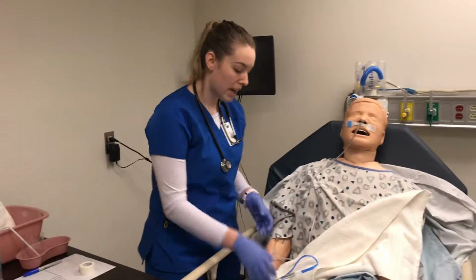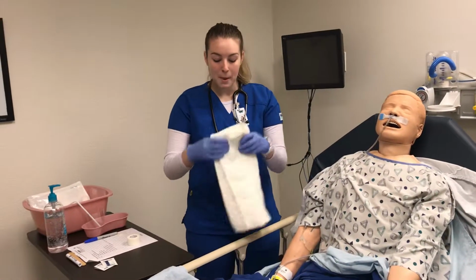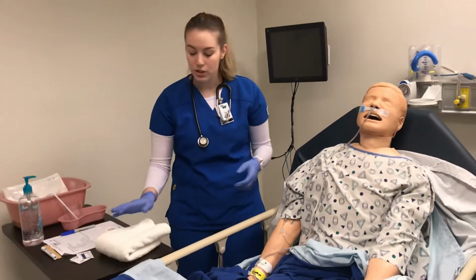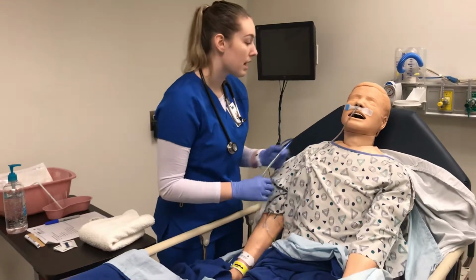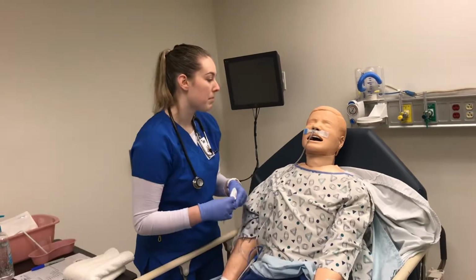Okay, Shirley, so how are you feeling? You're okay? Oh, that's good. Okay, so I'm going to be back in a little bit to check on you. We're going to get an x-ray to make sure that the tube is in place before I can hook you up to suction to help with that stomach pain.